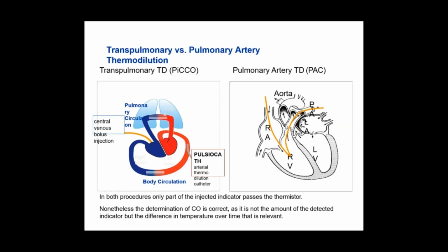So this technology, pulse contour analysis technology, can be used for the trend. An analysis of trend will give you a fair idea, but for absolute values always go for a PA catheter. There are many other aspects like the tone and the compliance and the arterial elastance and so many other factors which influence. So the pulse contour analysis may not give you the exact accuracy of cardiac output in an isolated way. That's why the trend is important. And in the PAC you can get absolute value.